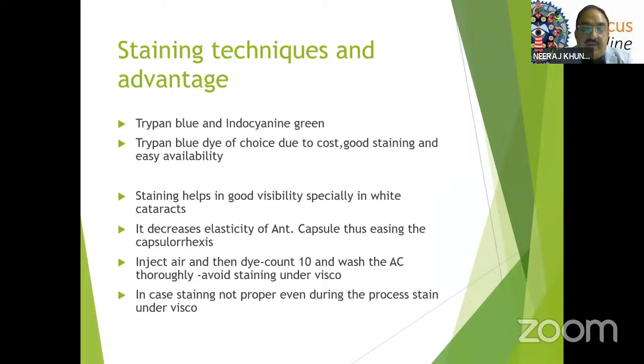Avoid staining under visco, but in case staining is not proper or you decide to stain later on, you can always do it under visco. There is no harm in that.